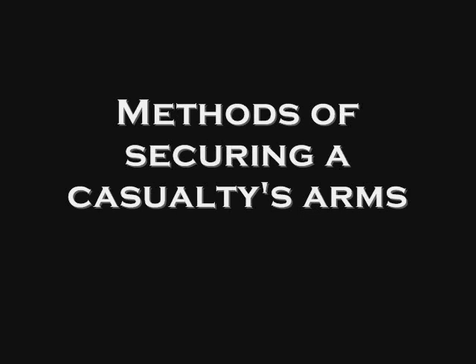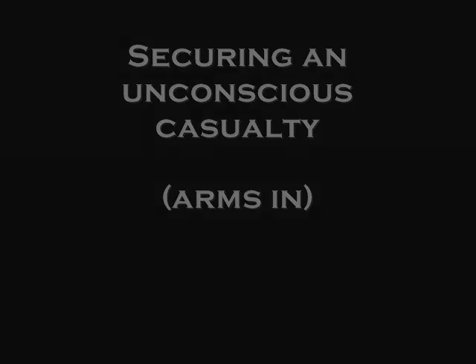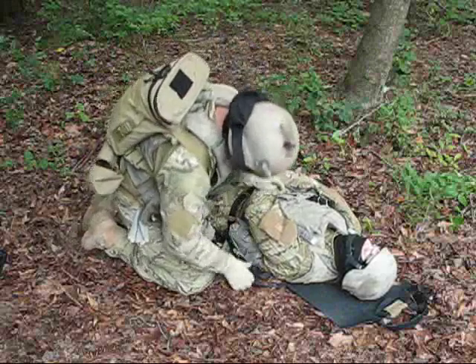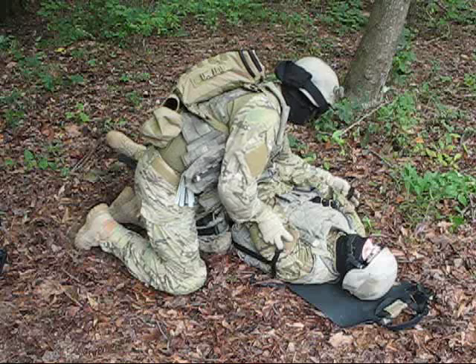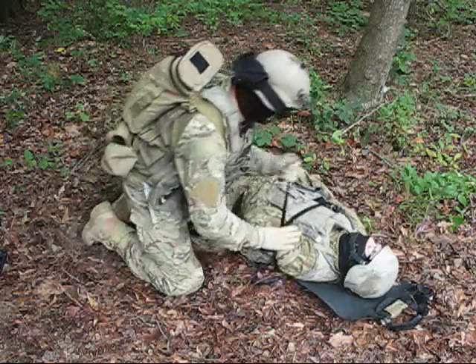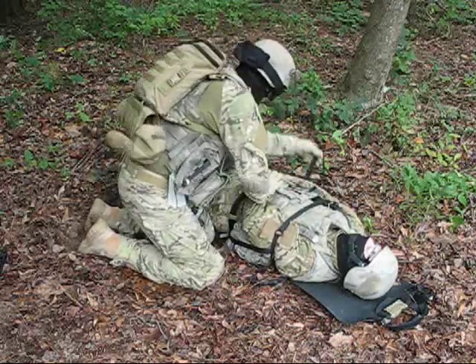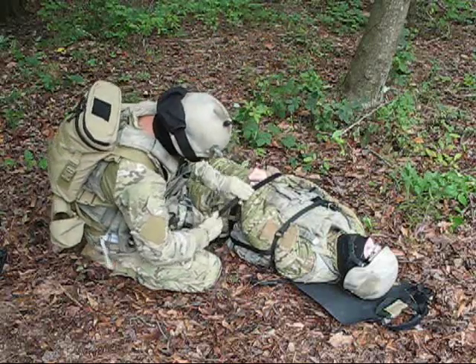Methods of securing a casualty's arms. To secure an unconscious casualty, place his arms on his stomach. Then secure the chest strap over his arms. The waist strap is then placed over the patient's wrists or arms and secured.